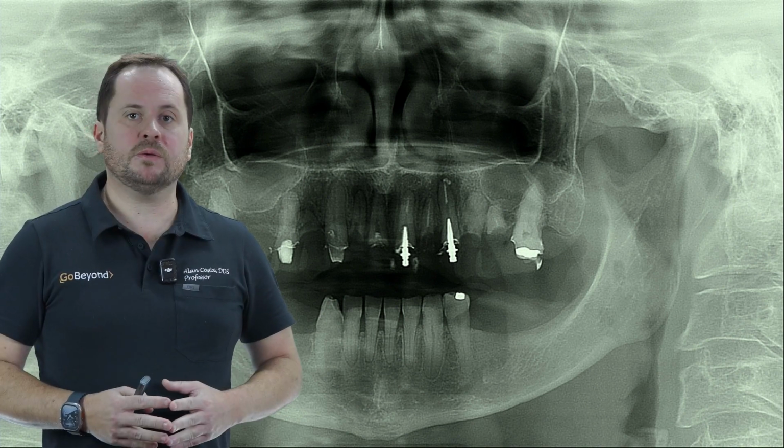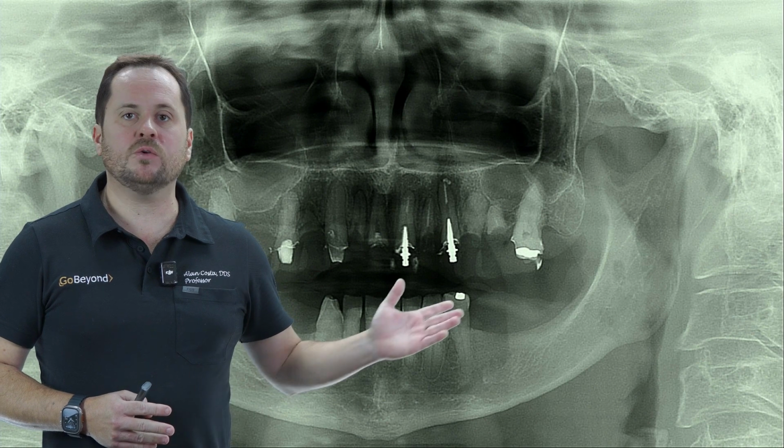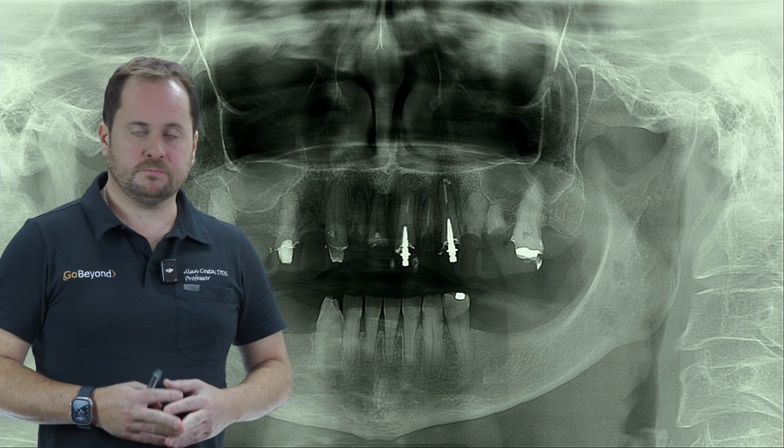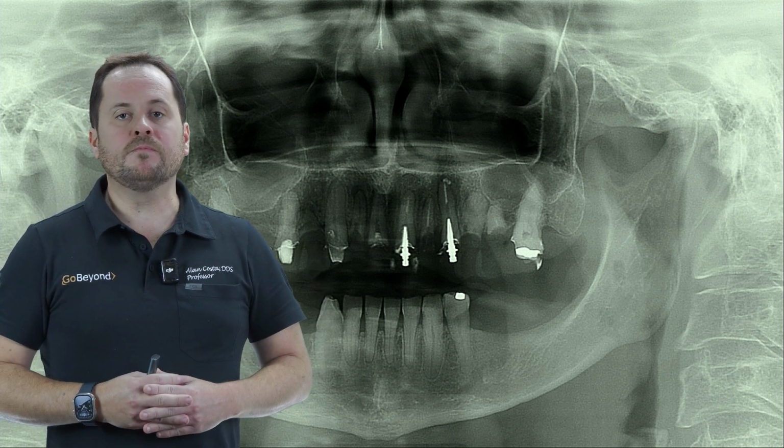I believe that many people who are watching this case will likely look at a case like this and think, oh, extract everything and place a protocol. Many people would do it that way.